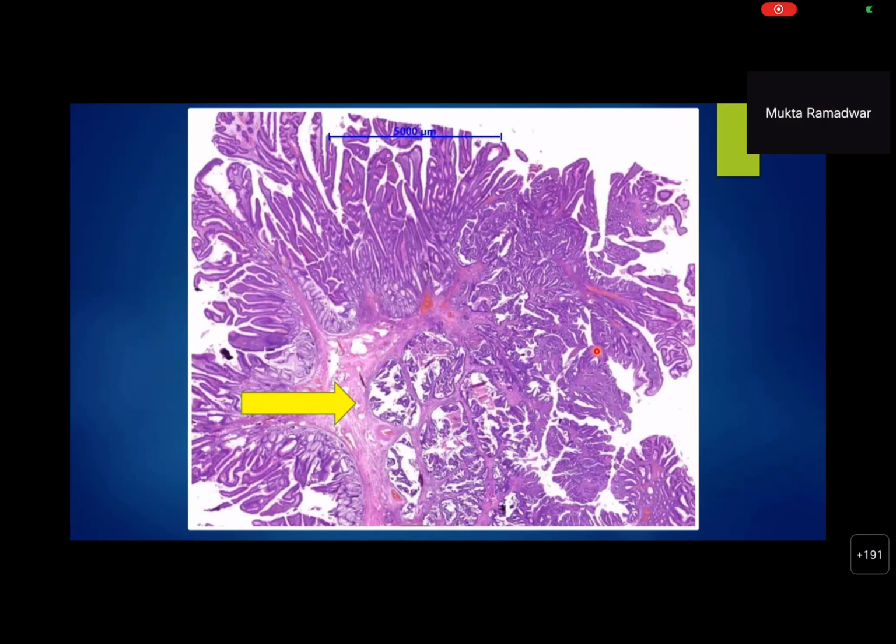Now, I'm highlighting some other finding here with this arrow. Can you focus on that? Yes, ma'am. This is suggestive of some stromal invasion, and the neoplastic glands are pushing into the pedunculated stalk. Okay. So there is some stromal invasion, and most probably the muscularis mucosae layer is invaded, and the lamina propria and submucosa. First of all, why are you calling this invasion? So, do you think this is an adenocarcinoma? Ma'am, adenocarcinoma. If we call it invasion, then carcinoma will be there.